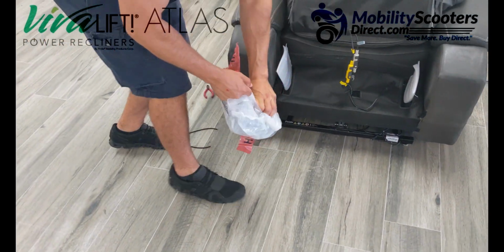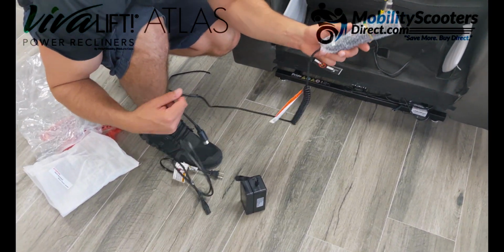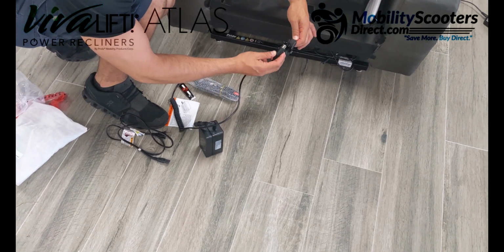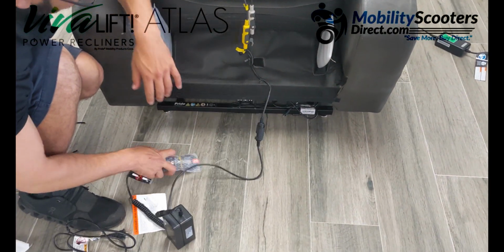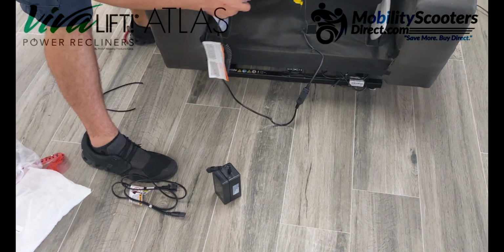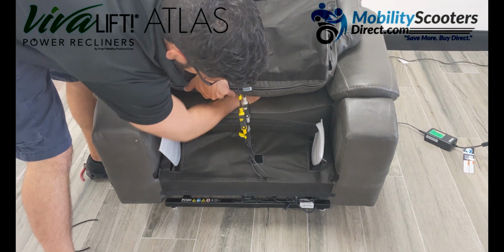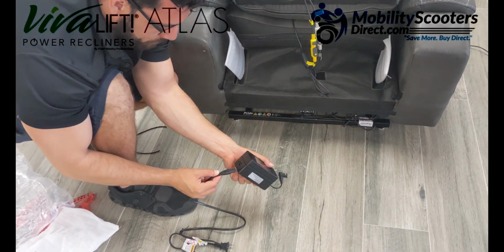So here's the remote control, which has the black harness, which is going to connect to that 3rd harness coming out of the base of the chair there. There's no wrong way to do it. Just plug it in and put the clip down to secure it. The remote control, you'll want to slide through the middle, right underneath the back of the chair, and rest the remote control on the seat. And that'll be the best way to prevent it getting pinched on the left and right side.